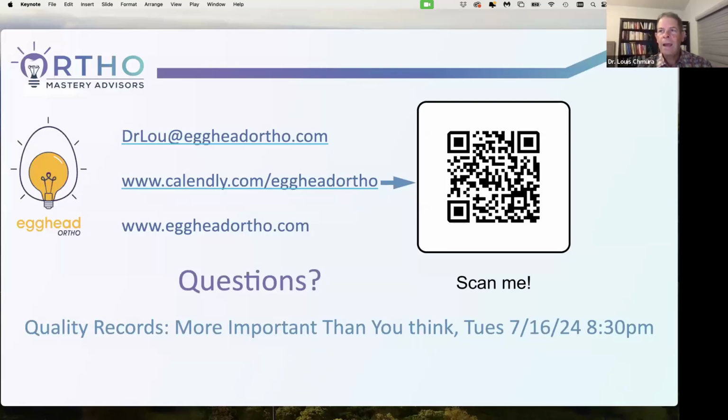So you bring the root out more, you're going to then have some other issues. 4 or 5 millimeters, it depends on how big the crowns are, but I suspect you're going to need to do root canals, post and buildup, and some sort of crown on them, because the further you go up, the narrower they're going to get. So you're going to be at a point of the upper, I guess, right incisor, right lateral, where it is past the height of contour.